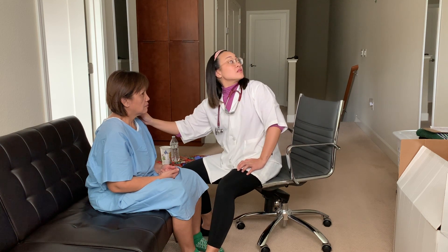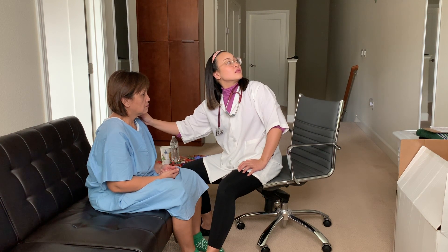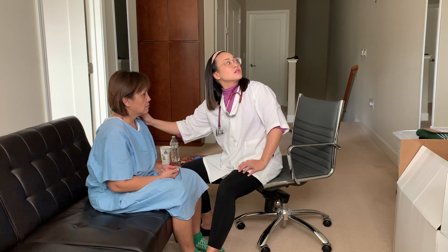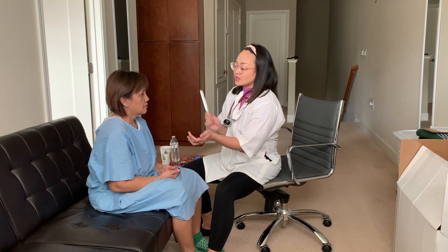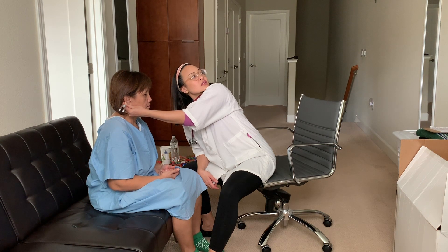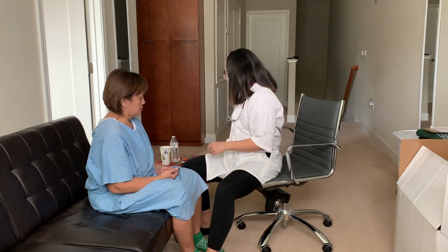Let me know when the ringing stops — testing bone and air conduction on both sides. She has good hearing.